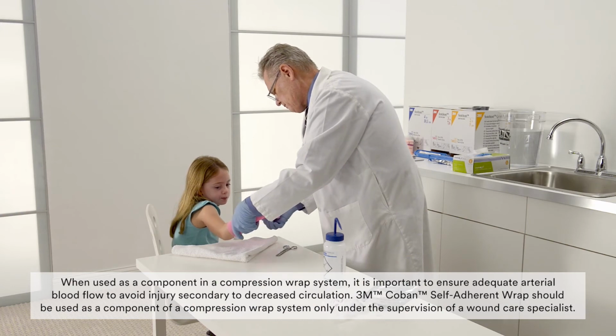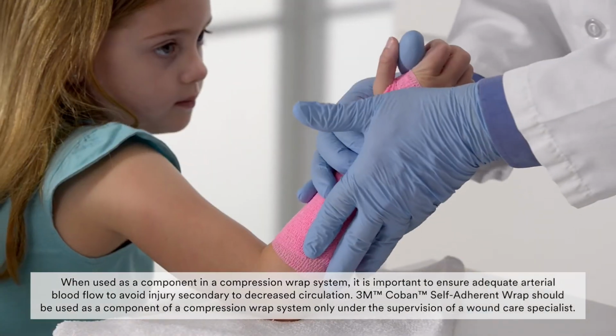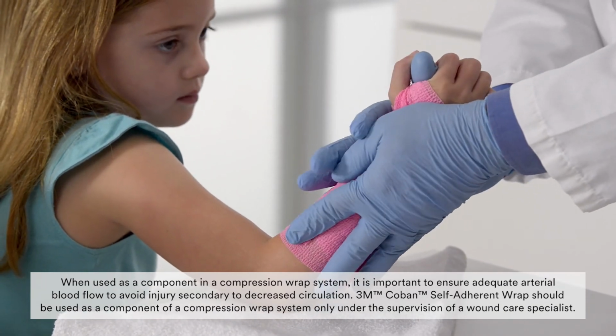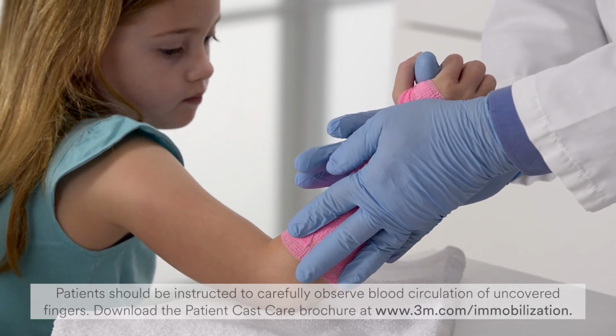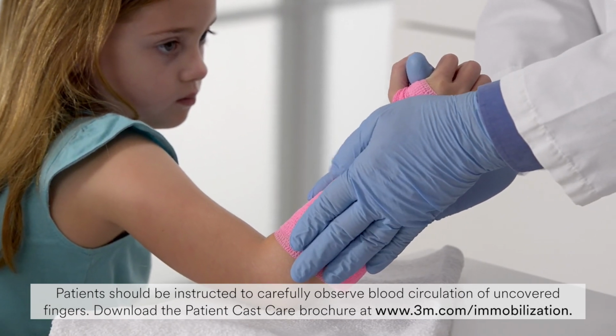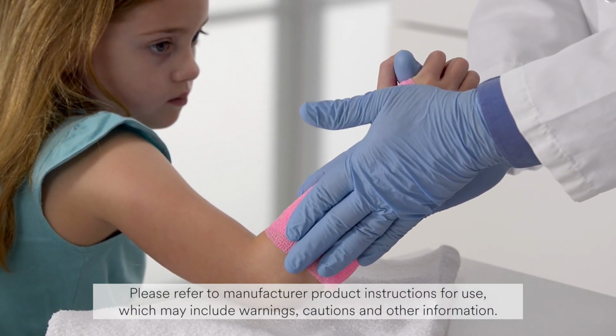Mold the palm of the splint by holding the patient's thumb between your thumb and forefinger and pressing the ball of your hand into the palm of the splint. Keep the arm still for 3 to 4 minutes to ensure the splint sets. The splint will be fully cured within 20 minutes.